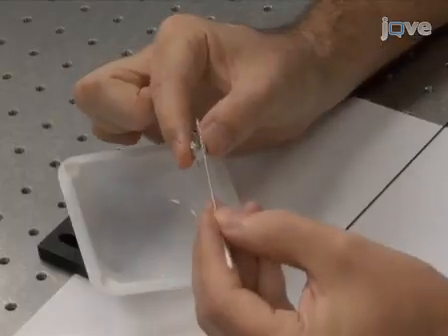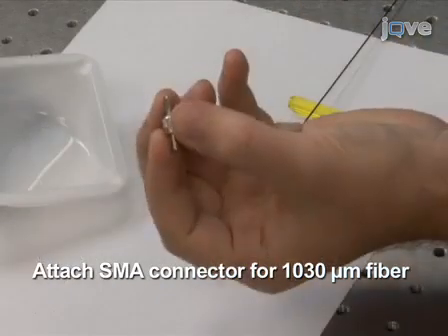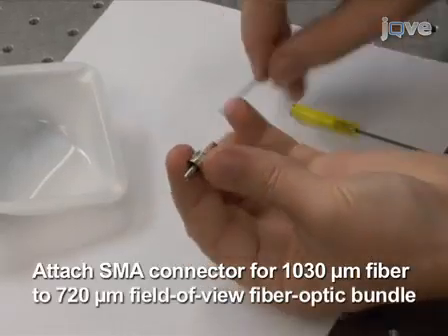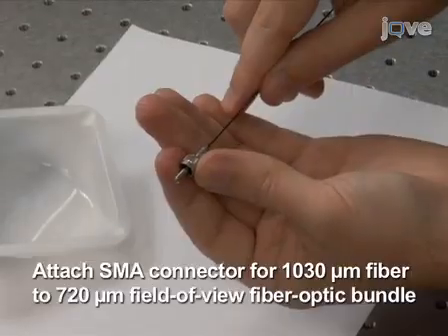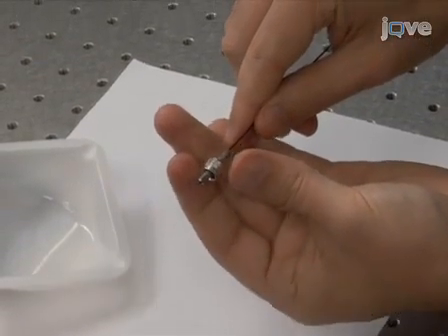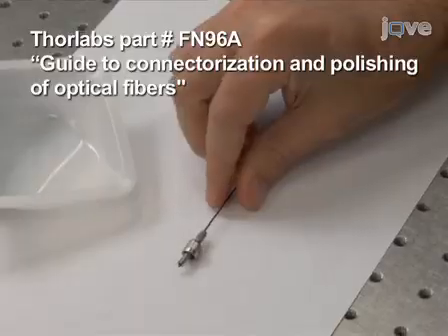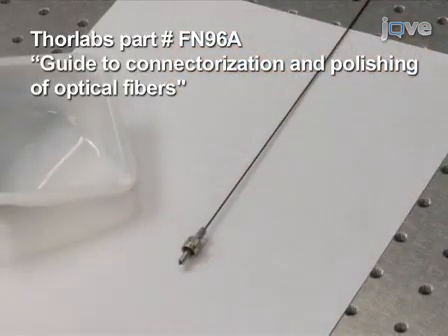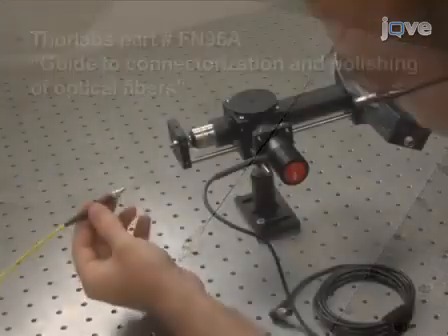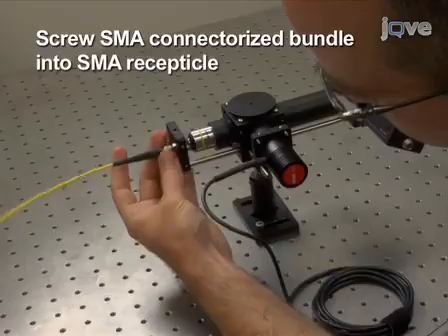Using epoxy, attach an SMA connector for a 1030 micron fiber to the 720 micron field of view fiber optic bundle. For details on fiber optic connectorization, refer to Thorlabs part number FN96A, Guide to Connectorization and Polishing of Optical Fibers. Screw the SMA connectorized bundle into the SMA receptacle mounted on the cage rods.